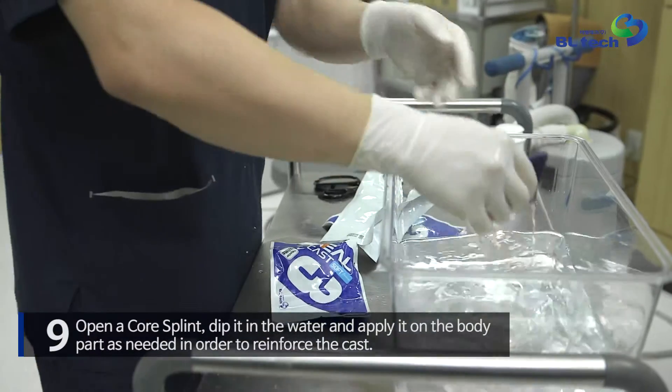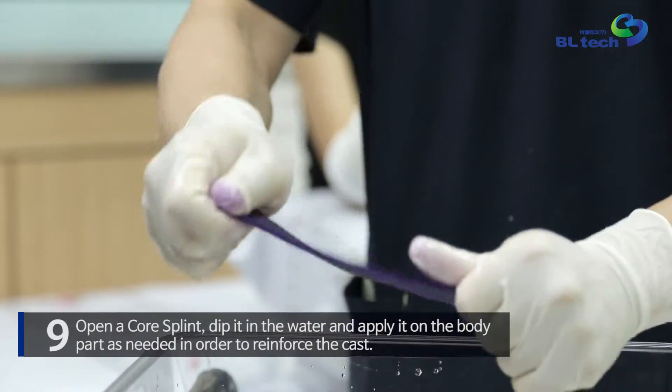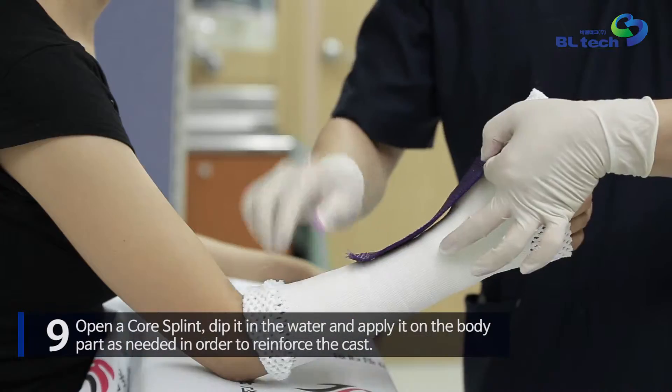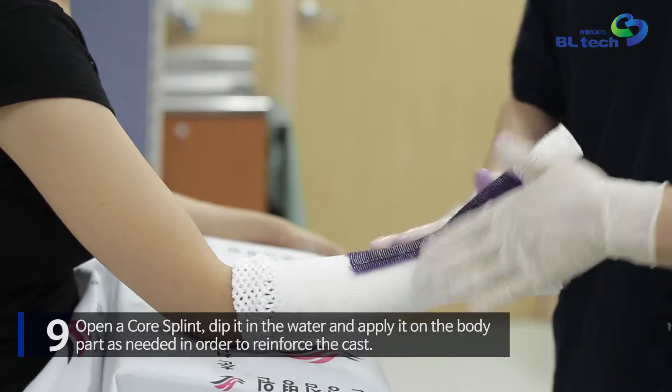Open a core splint, dip it in water, and apply it on the body part as needed in order to reinforce the cast. In this application, the core splint is applied from the thumb and radius area.